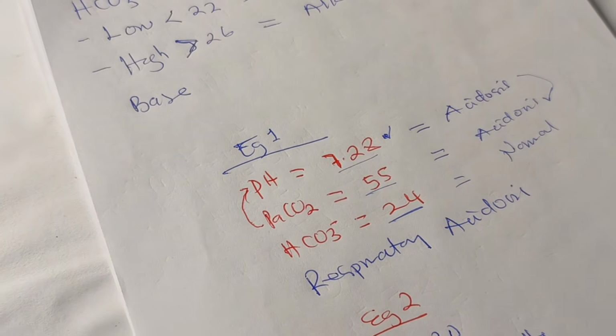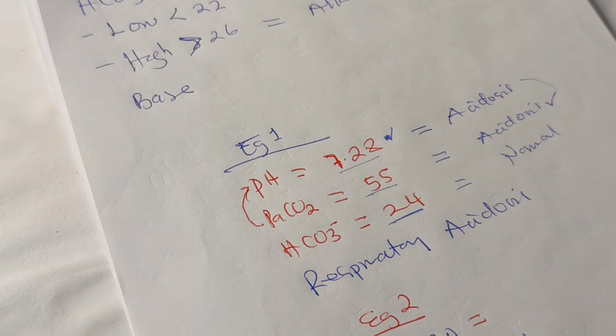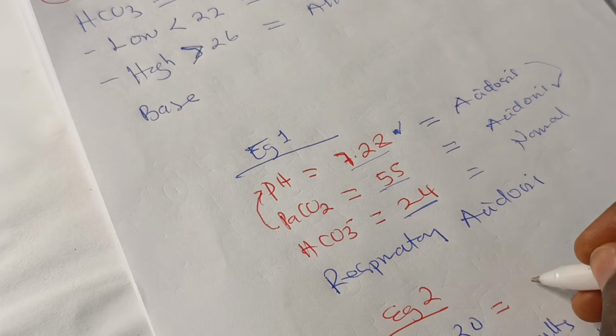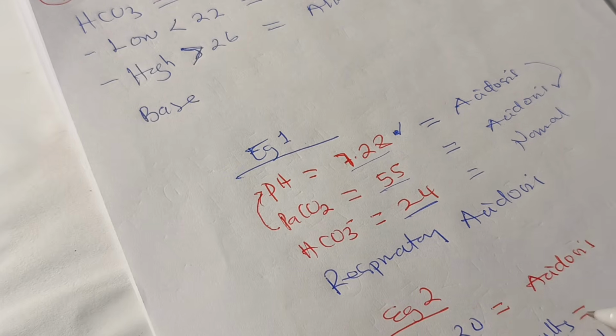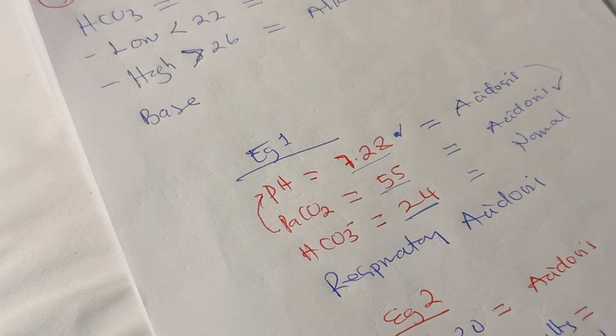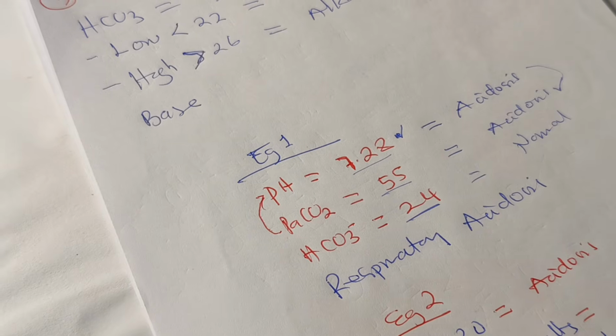So here, is this normal? No, it's low. So this is what? Acidosis. This guy here, is it normal? Yes, it's normal.